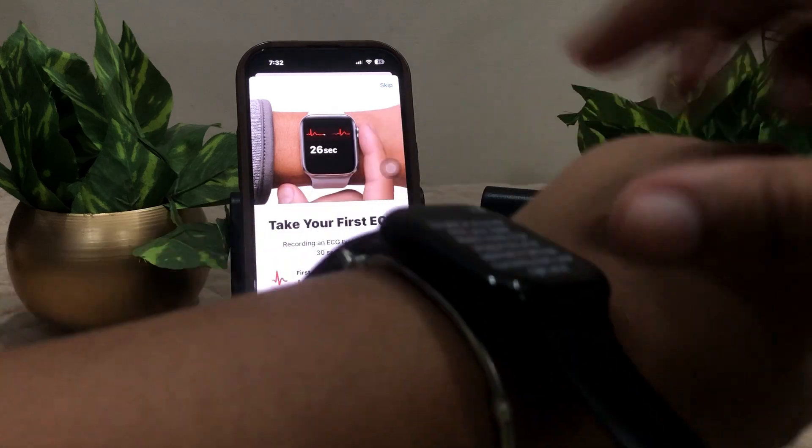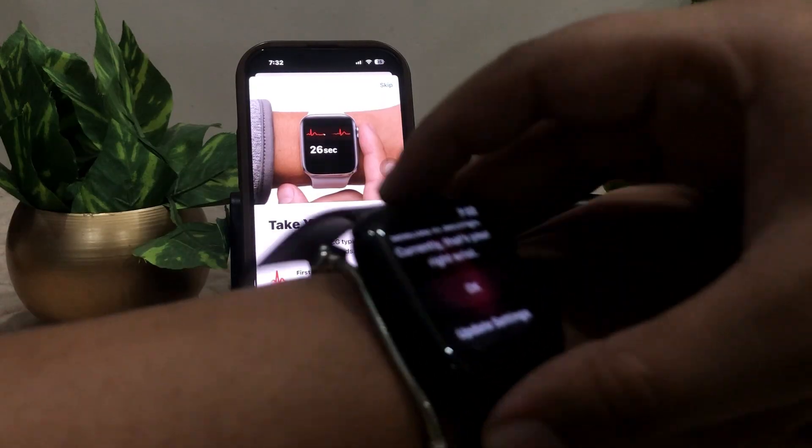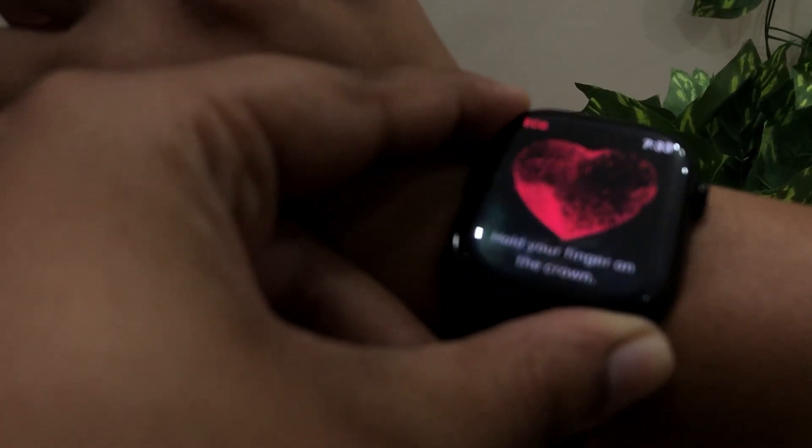Now wear your watch on your right wrist. It says to wear it on your right wrist — click on OK. As you can see, it just starts working. Hold your finger on the crown.